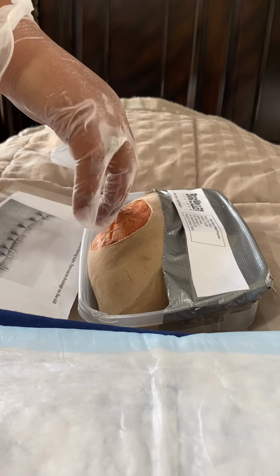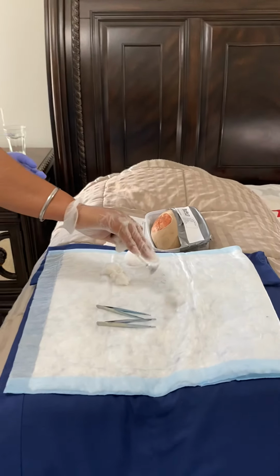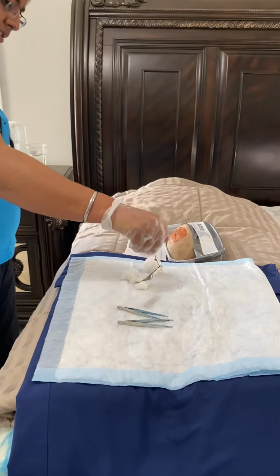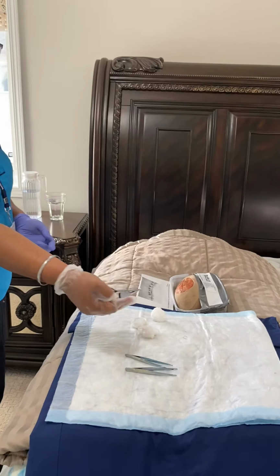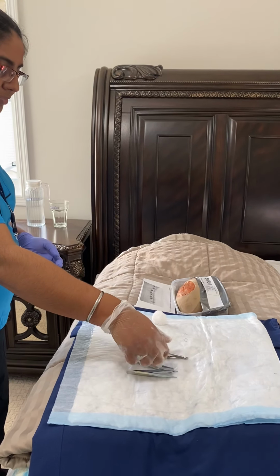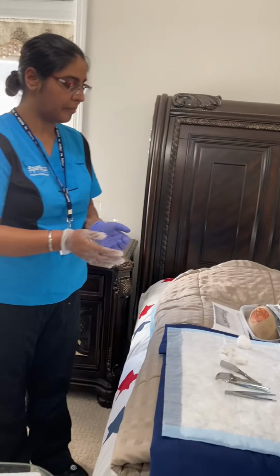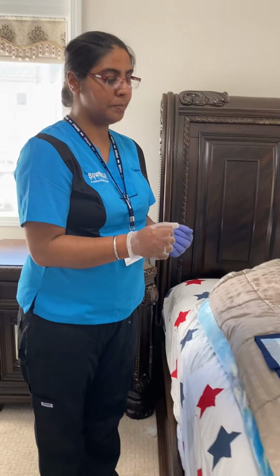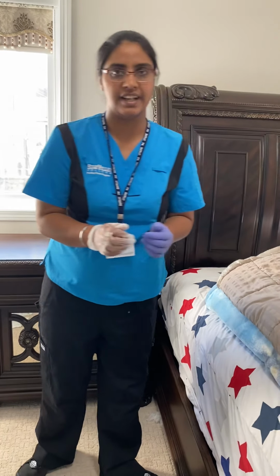So there are 5 remaining staples that I didn't remove. I removed 3 staples and 5 are left. So I don't need this staple remover now, so I'm going to put it on the side. Now I'm going to put steri strips on the staple removal site.